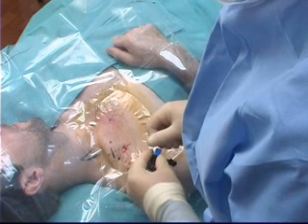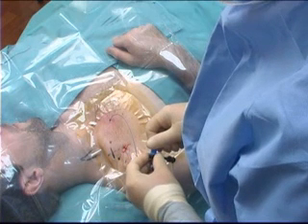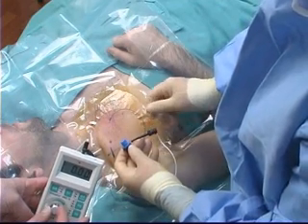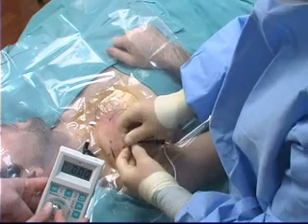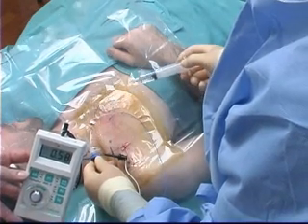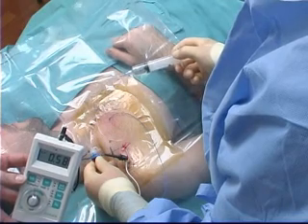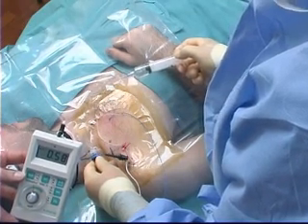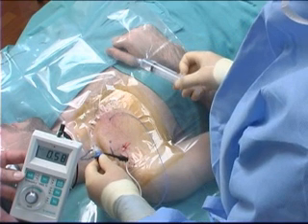The nerve stimulator, set to an output of 0 milliamps, is attached to the snap lock and the nerve stimulator output is slowly turned up until a muscle twitch can just be seen. Local anesthetic agent or any conducting fluid such as normal saline can be injected through the catheter and the muscle twitches will stop immediately once the injection is started. This constitutes a positive Raj test that gives further assurance that the secondary block will be successful.